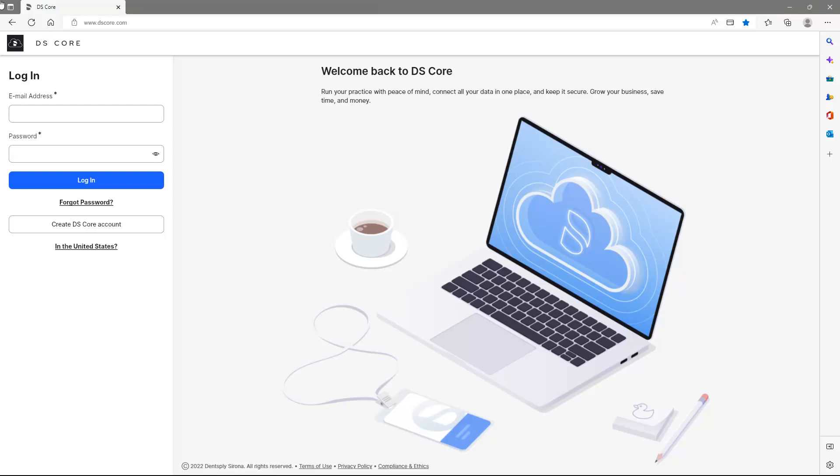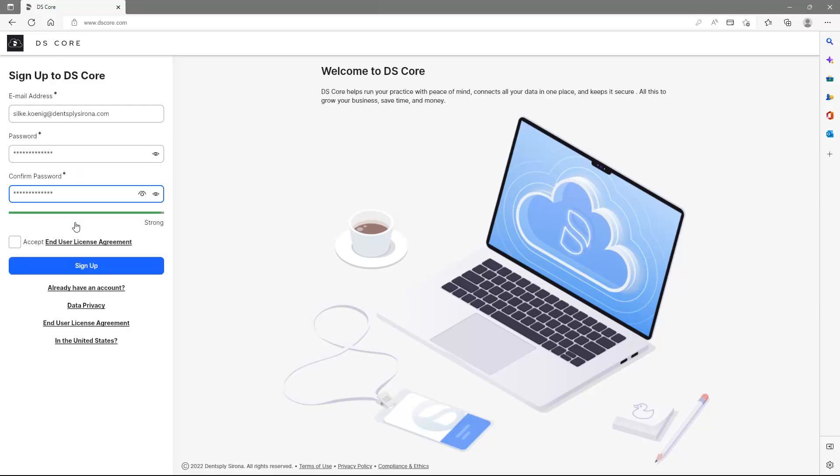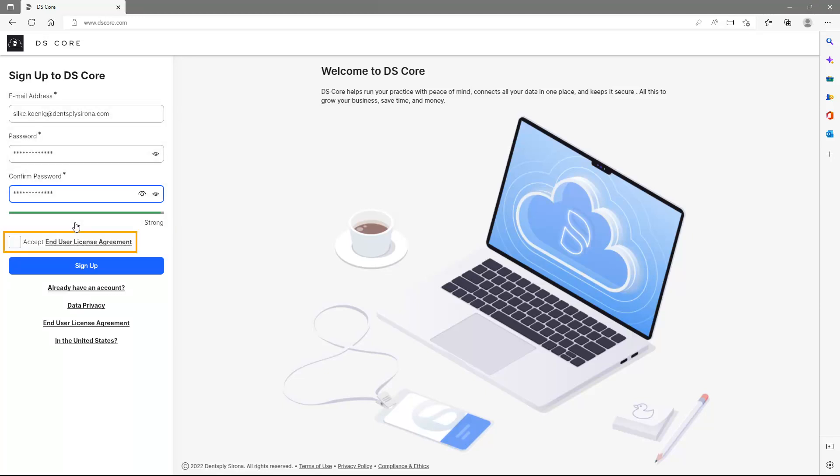To register for the first time, please tap the Create DSCore account button. If your practice is in the United States, click In the United States first. After entering the email address and defining a password, we accept the End User License agreement and confirm with Sign Up.